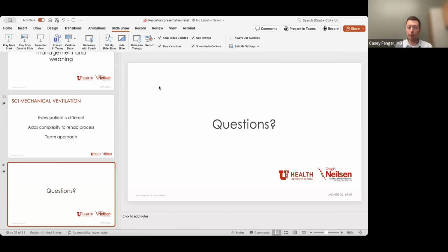One thing, or a couple things that people have published on, is doing diaphragm EMGs as well as diaphragm ultrasound. These are things that show quite a bit of promise. One of the problems with the diaphragm EMG is that it's very technically difficult to do. And I'm not very excited about sticking an EMG needle into someone's diaphragm for a multitude of reasons, right? And so it's practically more challenging. The ultrasound is interesting, and I think that's the direction things are probably going to go towards.